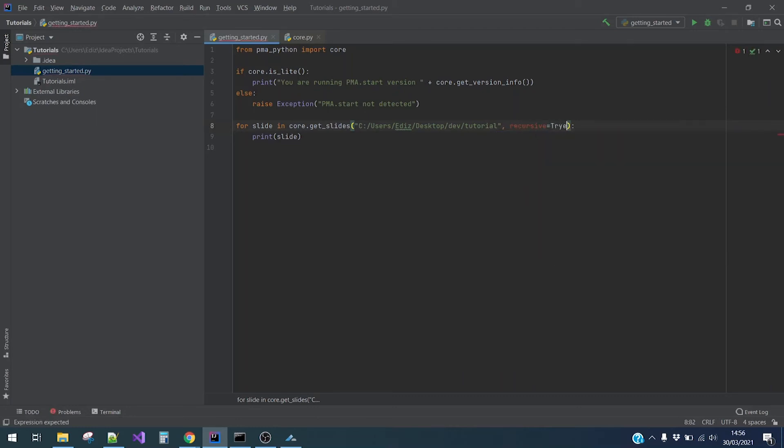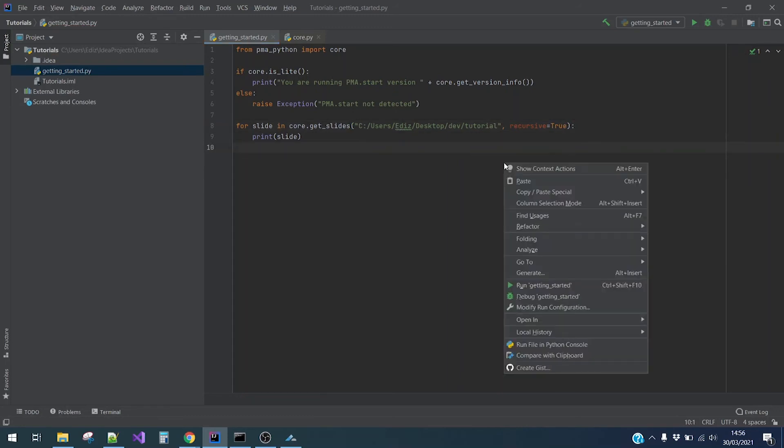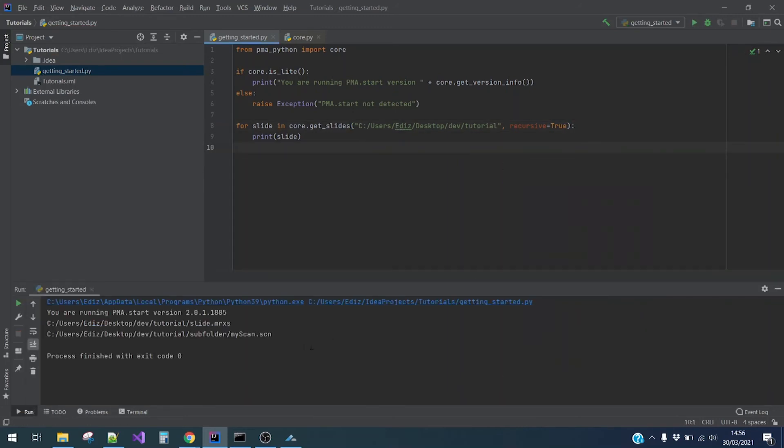And okay, true. And then we will run the code. Now we can see that it also returns slides from the subfolders. Great.